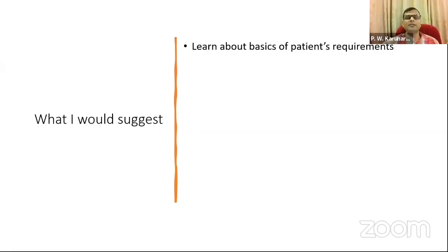When you look at the patient to see how much minute ventilation they generally require, it's about 100 ml per kg in a normal situation. Say in a 60 kilogram person, it would be about 6 liters. So you can get 6 liters in, say, 500 ml into 12 or 600 ml into 10, things like that. You can have various combinations, but that ventilation is important.